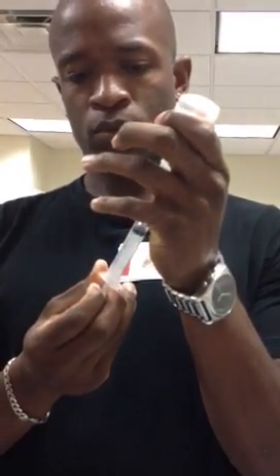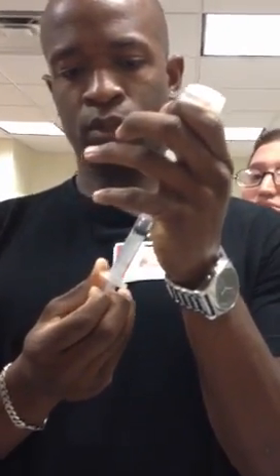I'm going to inject air in, and then withdraw. Everybody has to do this. You have to inject air, otherwise you'll be like this. When you come to the floor, the patients don't want to see you like this, okay?